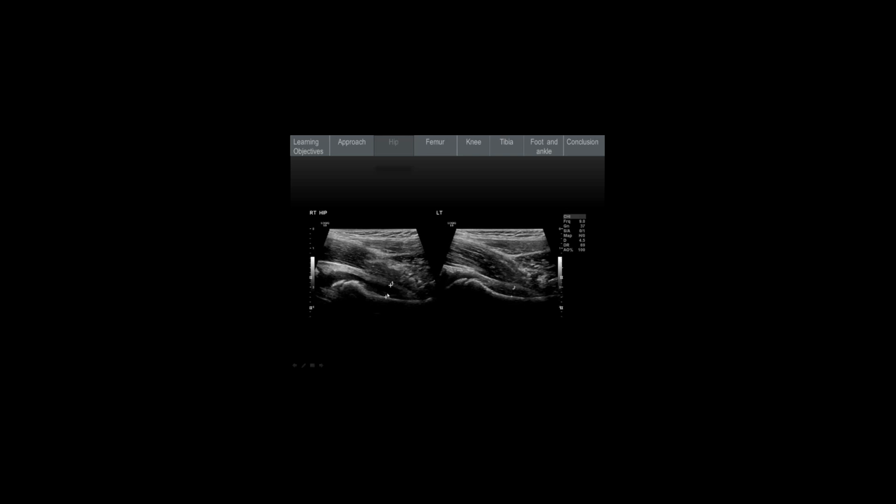And what you can see here are some calipers on the ultrasound. You can see on the right hip there's some calipers measuring something which is very low echogenicity or dark, and something also on the left. This is fluid now in both of the patient's hips. Before, recall, we only had fluid in the patient's left hip, and now we have fluid in both of the patient's hips. Ultrasound is very good for detecting joint effusions, particularly in the hip, particularly in children, because you don't have the problems with obesity that sometimes you have in an adult population.